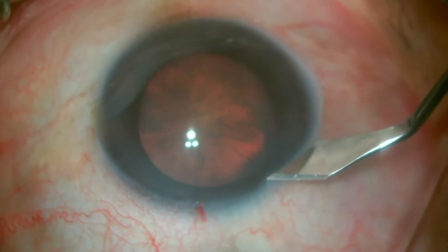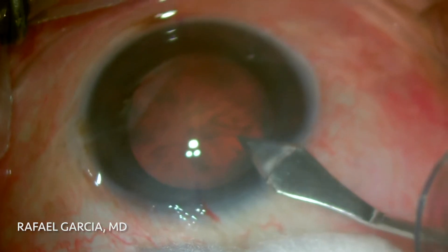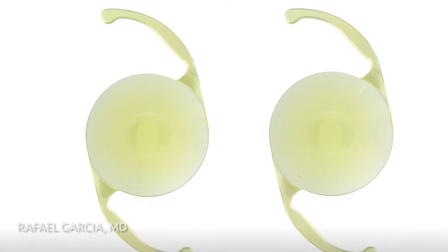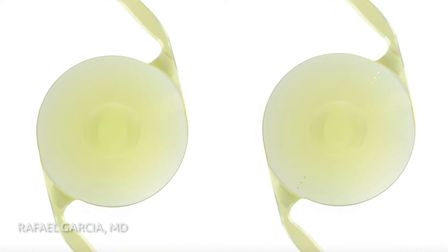This is a routine cataract surgery in which the IOL chosen was the Alcon Vivid lens. This IOL is on the standard Acrisoft platform, so it's a single-piece acrylic lens, but it has a central zone modification that elongates the depth of focus, providing better intermediate vision for the patient.